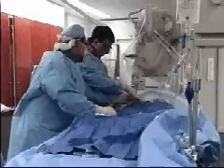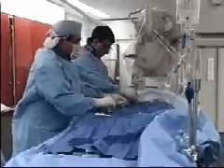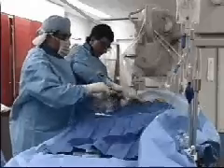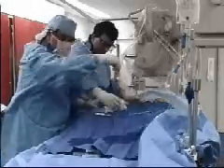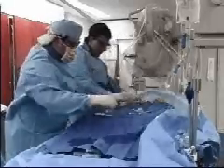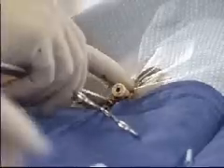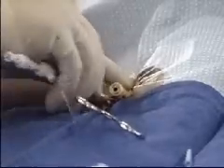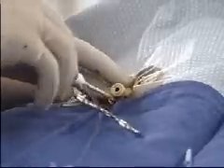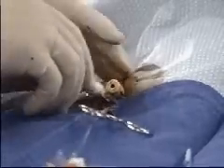A special cardiac procedure known as cardiac catheterization enables the physician to diagnose narrowing of the coronary arteries and in some cases correct the problem without surgery.